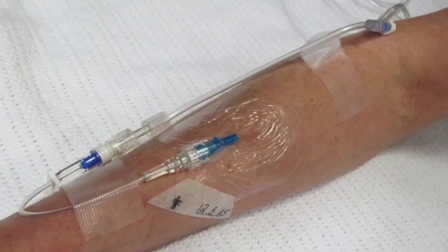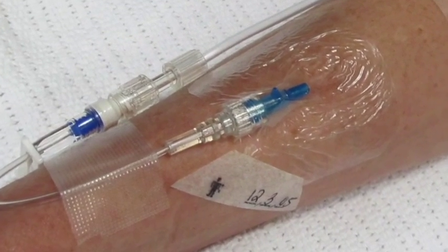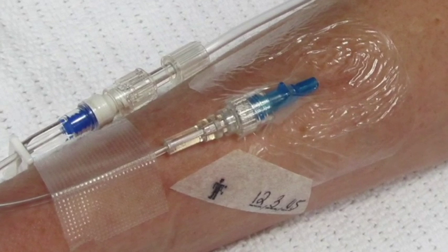Peripheral IVs that have been inserted under aseptic conditions that don't have signs of infection may usually remain in place for up to 72 hours. Although some clinical trials seem to show that leaving them in for longer than 3 days is safe, these studies were done under very different circumstances than are found in most hospitals. If a line is left in for longer than 72 hours, the risk of infection rises sharply.